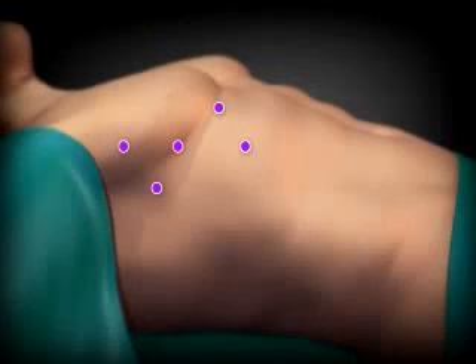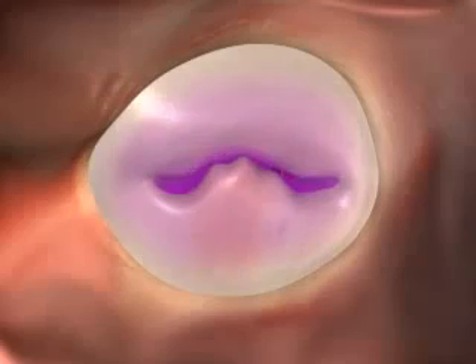We make keyhole incisions for the surgical arms, camera, and access tube. The tiny camera provides a view of the diseased valve.